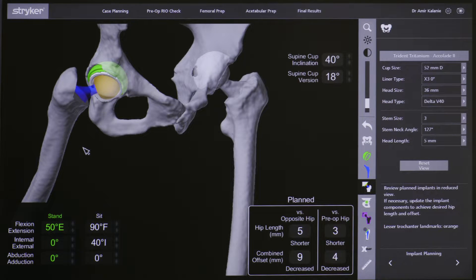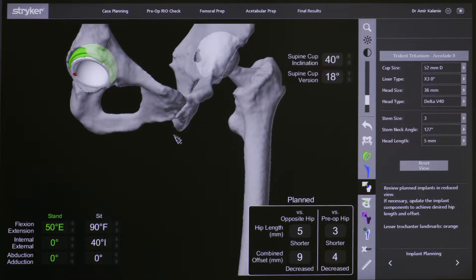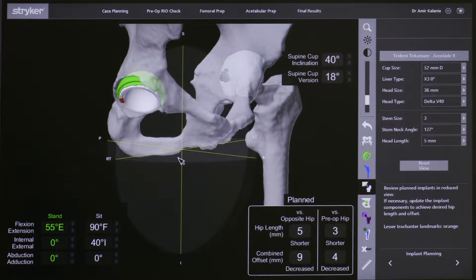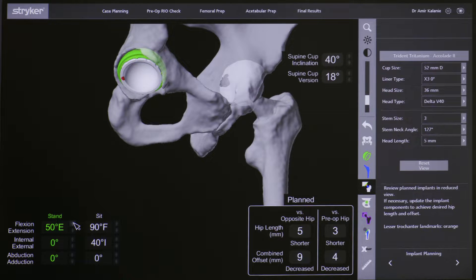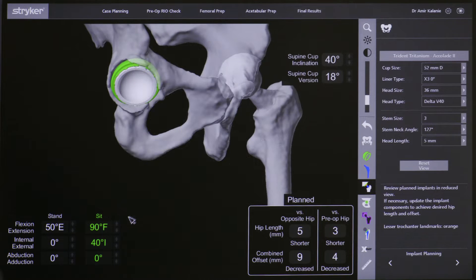One of the new features of this system is what we call VROM, or virtual range of motion assessment. Here we are putting the patient's leg into 50 degrees of extension to see if there is prosthetic impingement. The red area tells us that the femur is actually hitting the edge of the cup, and therefore we can make adjustments to the position of the cup to eliminate that impingement, which can lead to dislocation of the hip.